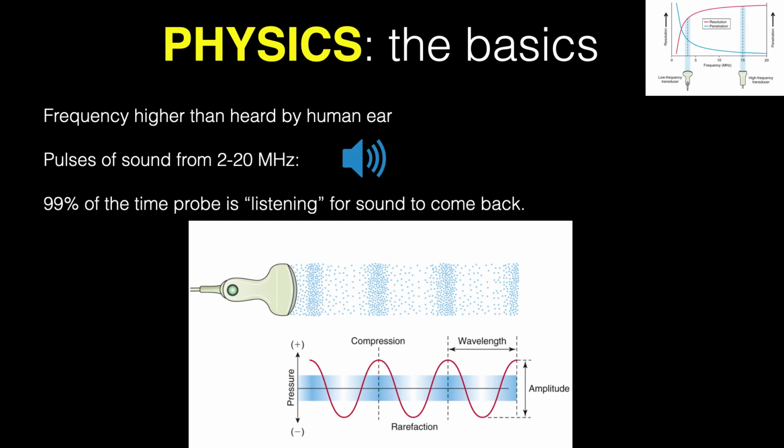It sends out a pulse of sound and it's listening for the sounds to come back, and by interpreting what's coming back to it, it constructs a 2D image.